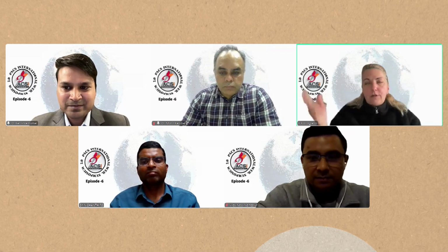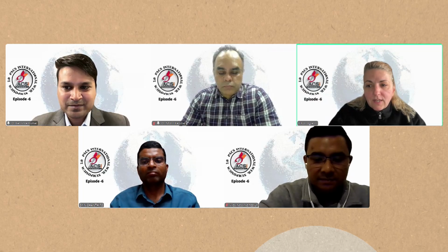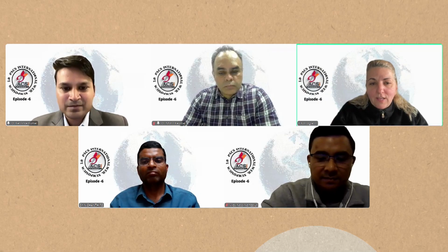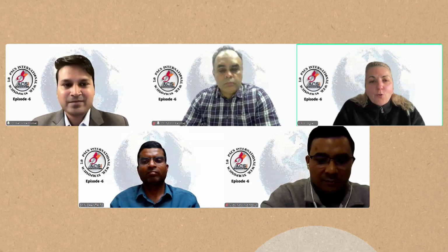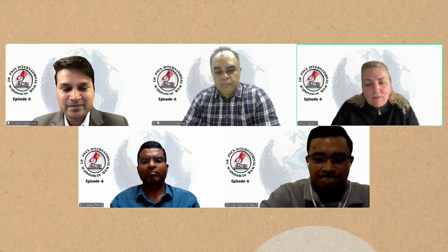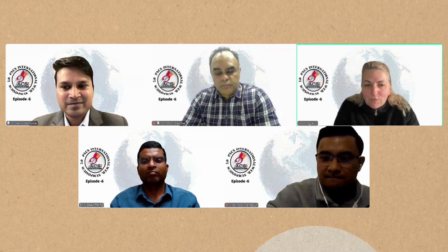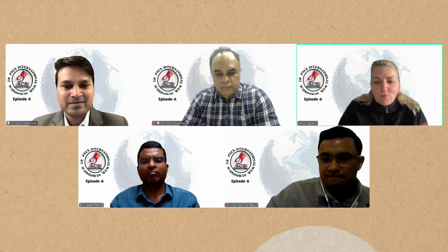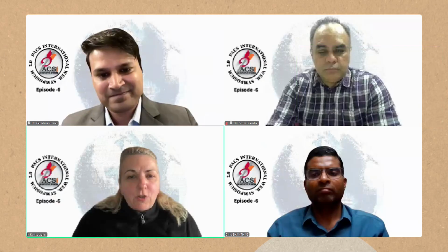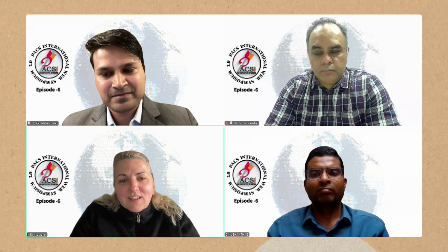What makes a difference in emergencies is that I would not be as careful as I am with the reusable one. So if I have the APC, who cares if I burn the tip of the bronchoscope? So I will come closer. If I don't have good contact, I will draw the probe back. So I try to be closer to get a good result, and I don't really care what happens with the scope. We're going to throw it away afterwards anyway. So this is, I think, a nice thing about single-use bronchoscopes.